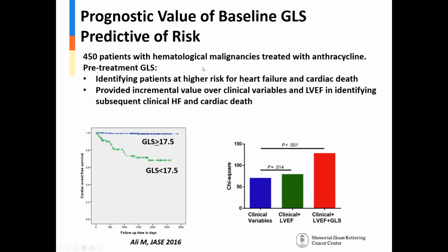With regards to the technique and quality check, for folks who do a lot of GLS, we have a policy that we do not take what the software provides at face value. We will check every single strain curve and confirm the value. So that goes to, what do you consider adequate tracking or inappropriate tracking?